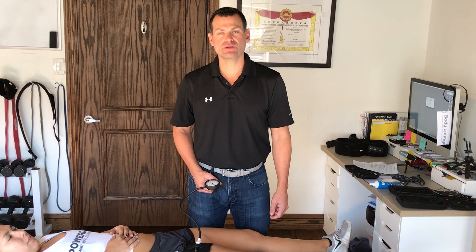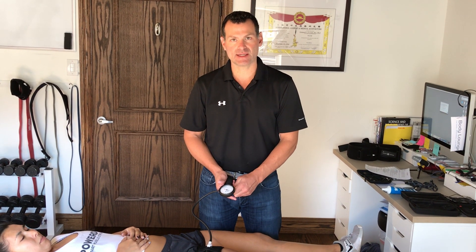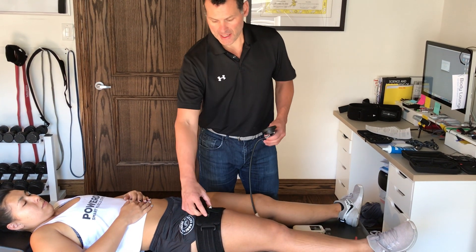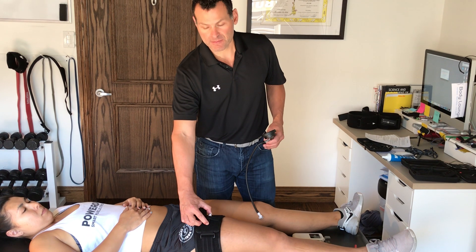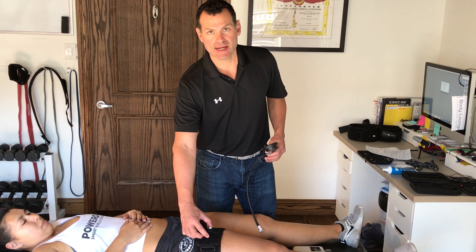When I want to reduce the pressure off of the cuff, I then deflate about 10 millimeters of mercury at a time, either using the sphygmometer like I am, or I can just press the stem and release air about 10 millimeters of mercury at a time.